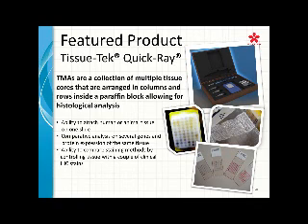Depending on what vendor you're choosing to do this test, also really read the literature. I cannot say that enough. Understanding what they're suggesting is the best way to retrieve this antibody from your tissue specimen is really, really important. Great, thank you. If you have frozen sections, is antigen retrieval necessary? It depends what type of method they're using, if they're running it on a conventional immunohistochemistry instrument or non-conventional. So a frozen section and how they're fixing it, I guess, would be my question.